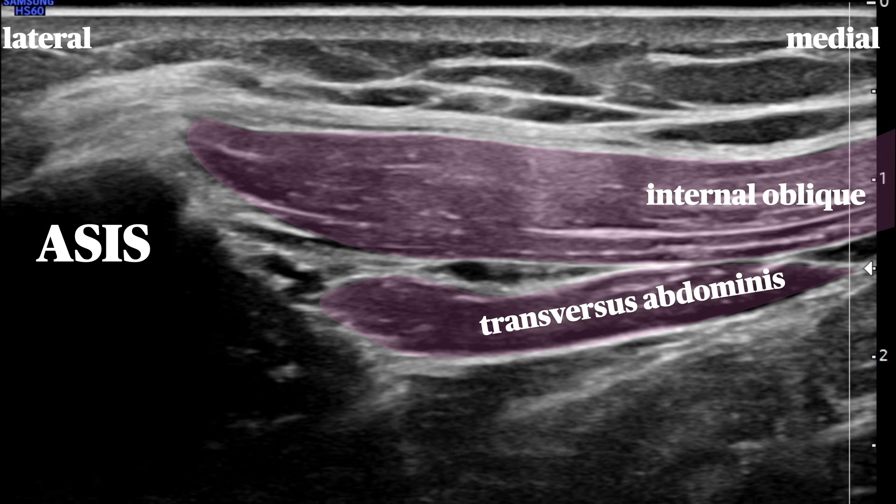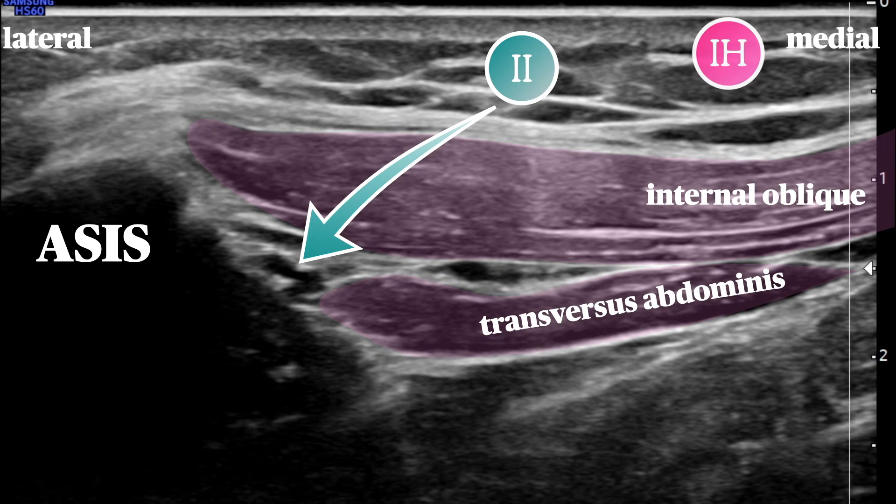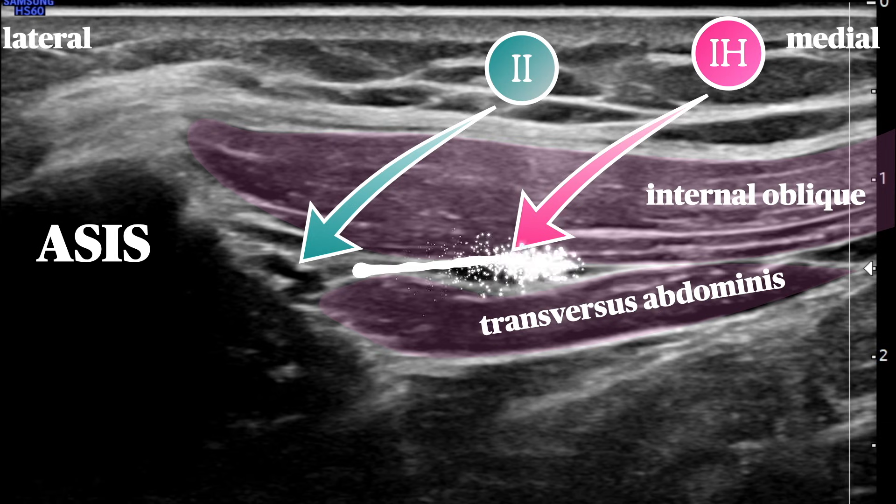Here's what we see on the ultrasound image. The ASIS is lateral, casting a large shadow. We see the internal oblique and transversus muscles with peritoneum below. The ilioinguinal and iliohypogastric nerves appear as hypoechoic circles within the intermuscular plane. Note that not all that is dark and circular is a nerve — there are vessels that travel with the nerves as well, and it's worthwhile putting on the color Doppler function to verify their position. The goal of this block is to place local anesthetic in this plane and peel apart the muscles.